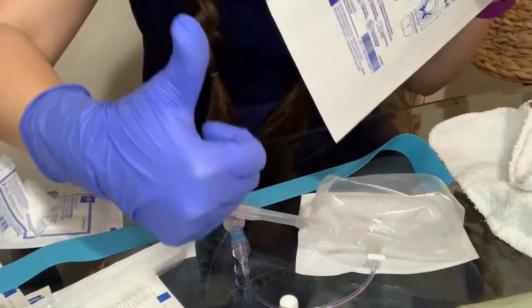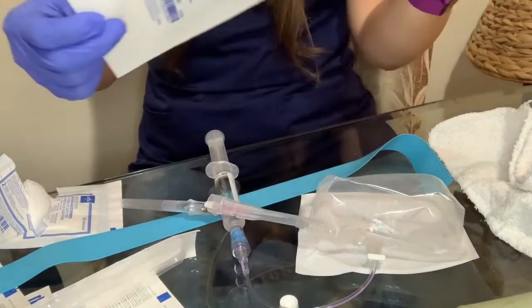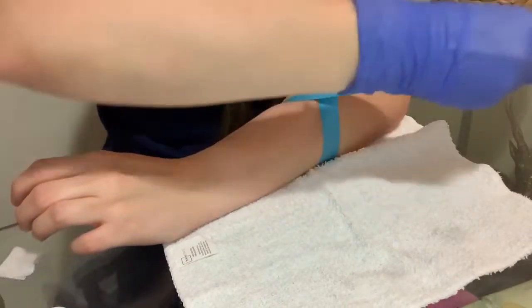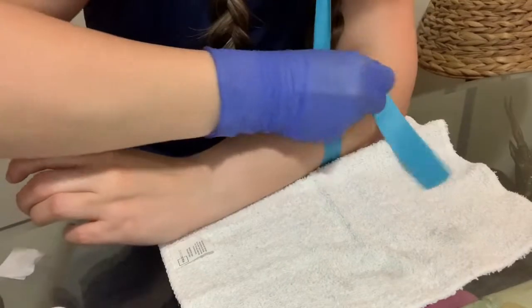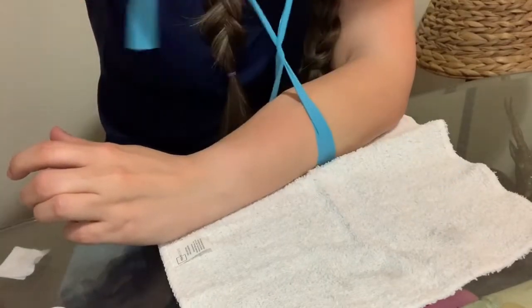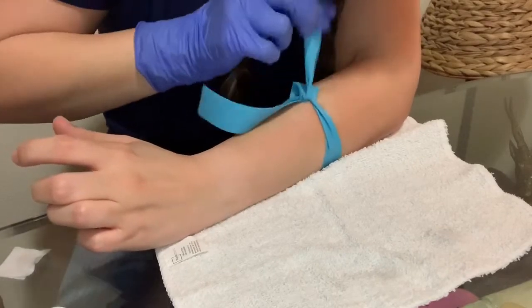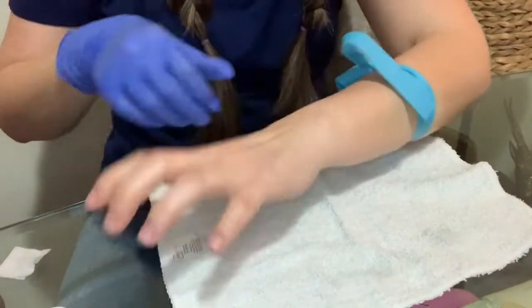Here is the dressing — I just want to show you that I have it ready. As you can see, I'm going to try to do the IV on myself, so this is gonna get real. I'm now putting the tourniquet in place.